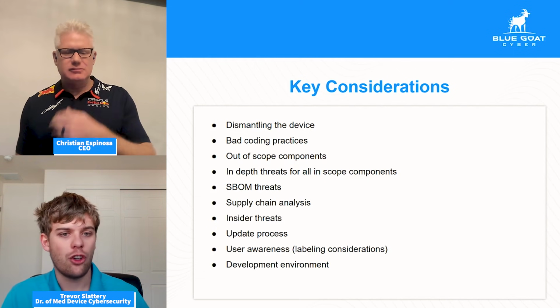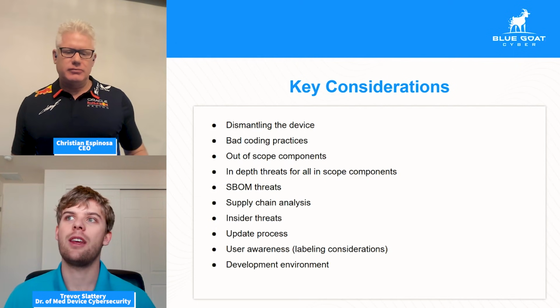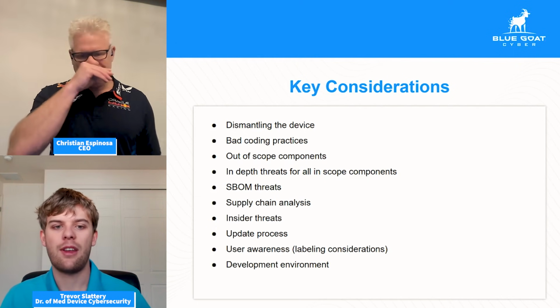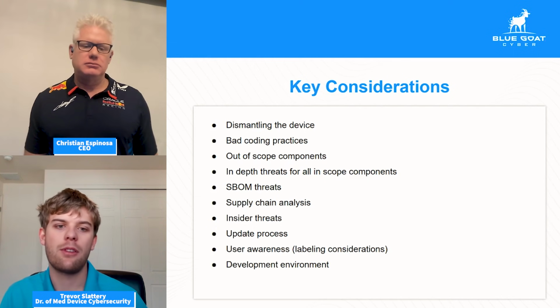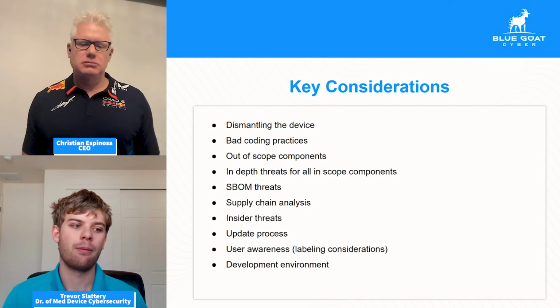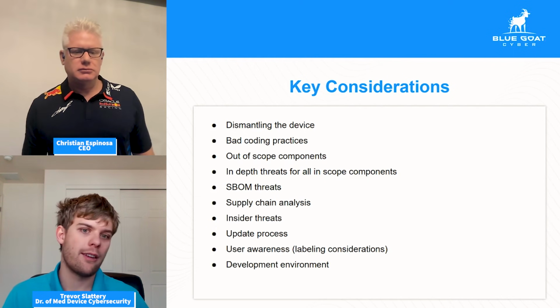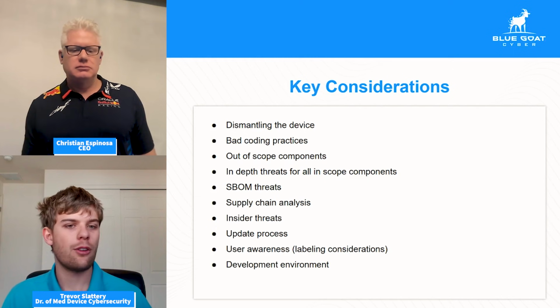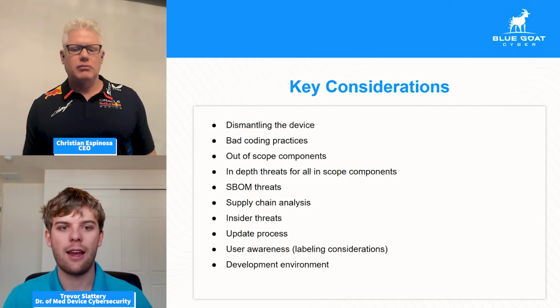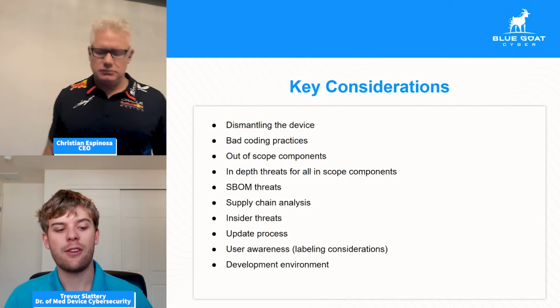It does a good job at catching a lot of the low-hanging fruit, but it helps get away maybe 90% of these easy problems, with the other 10% having to come in through some more in-depth, specific, targeted testing against individual functionalities. This is something that we like to consider early as possible. So as soon as we start threat modeling, this is something that we think at the front of our minds and discuss with clients. Coding practices should always be at the forefront of your mind for a couple of reasons.